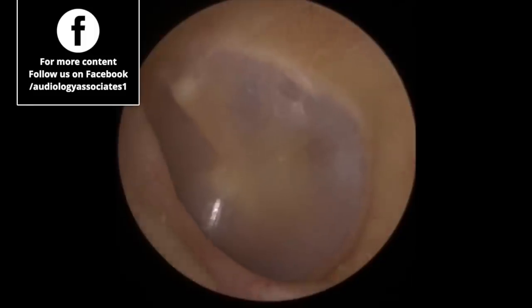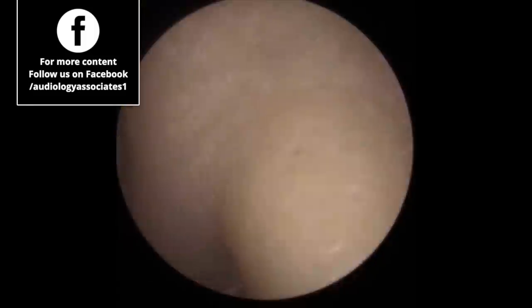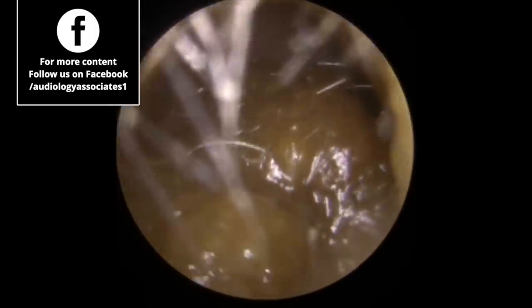Just removing a couple of little bits of finer bits of debris there. It doesn't always necessary to do this. If it's not going to cause the patient any discomfort and it's not too deep in the ear canal, we'll normally clear it away. If it was a lot deeper and wasn't really causing any problems, we would just leave it. Lots of people ask why we don't remove all the wax - it's not necessary. Your ear should have some wax in it, and the whole point is to get this person hearing better. You can see a lovely shiny eardrum there. By removing that first piece of wax, this patient would have heard a lot, lot better. Taking some of the other wax away is uncomfortable and you risk damaging the ear canal walls, which can cause even further problems. So it's not always a great idea to remove everything.